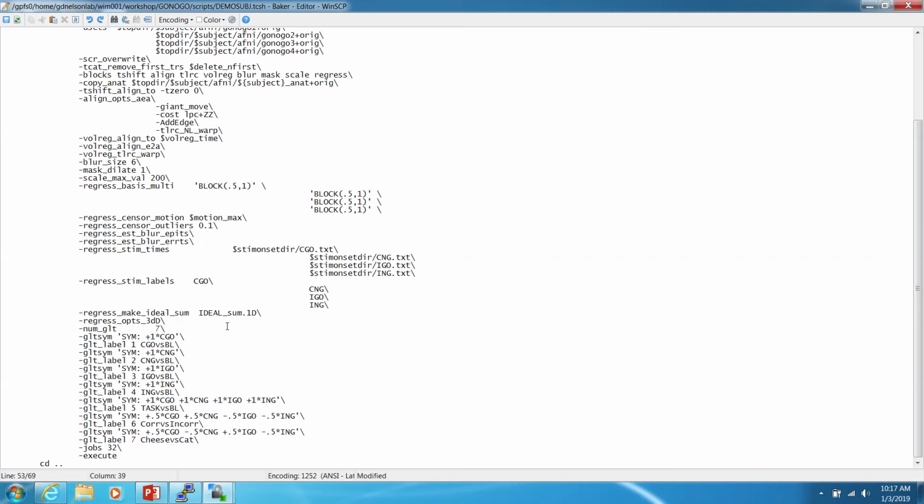So the primary way that you get around that problem is something called the subtraction method. Basically, you can take your image of interest, your event, and a summary of all the activation in those events, and then take another image that doesn't have your event in it, and subtract the signal in the two. Because that other image has all the junk you're not interested in, you can compare them, and it basically removes all of that. It's another way of getting through noise.